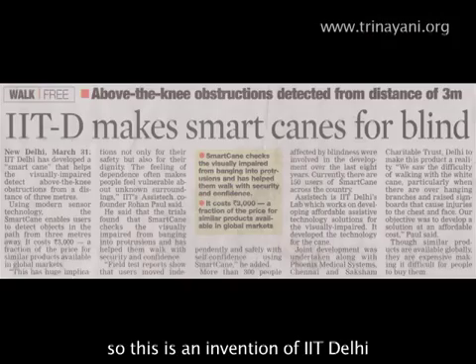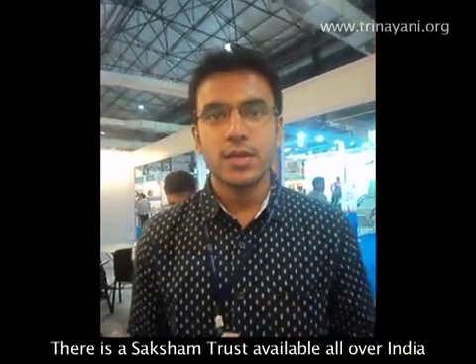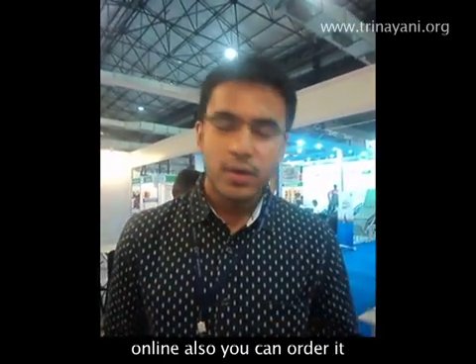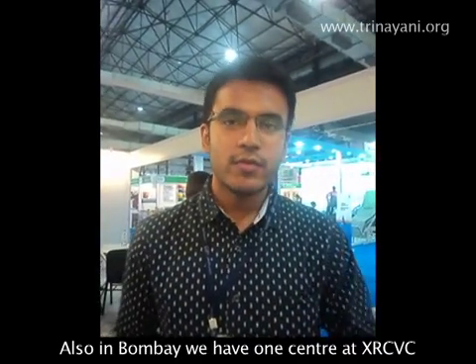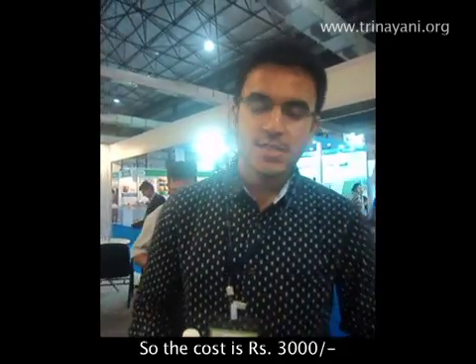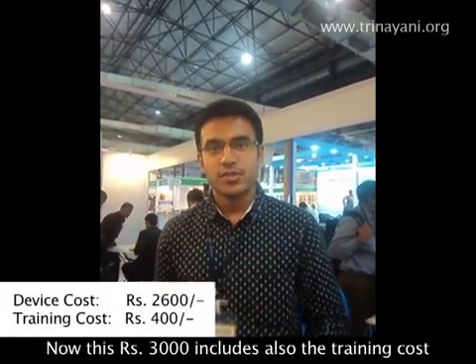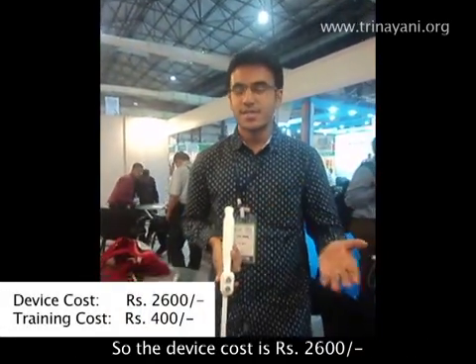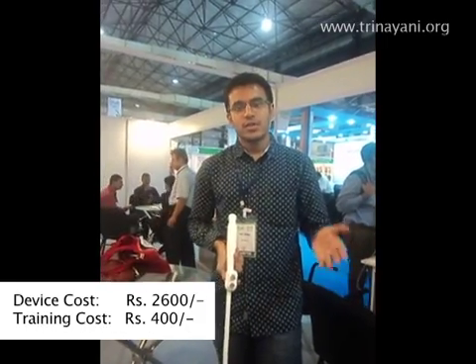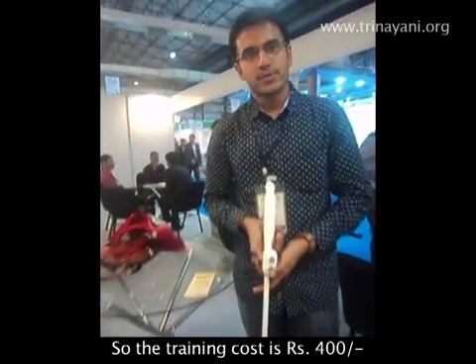This is an invention of IIT Delhi, and Saksham Trust is promoting it. There is a Saksham Trust available all over India, and you can also order it online. In Mumbai, there is one centre at XR CVC — Saint Xavier's Resource Centre for the Visually Challenged. The cost is 3000 rupees, which includes the device cost of 2600 rupees and a training cost of 400 rupees, as the device requires training before use.